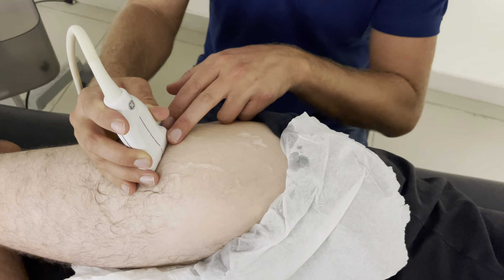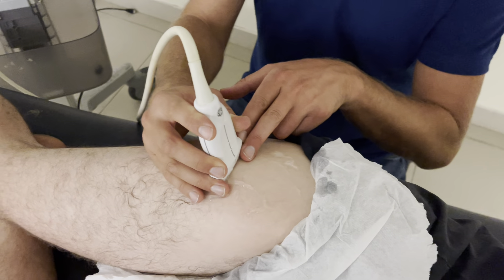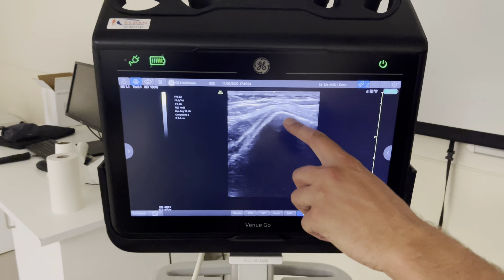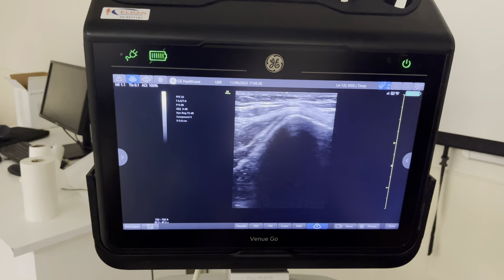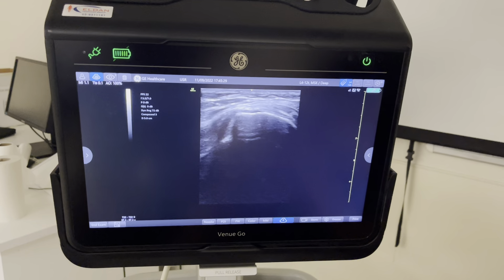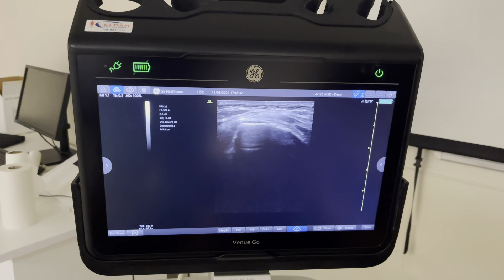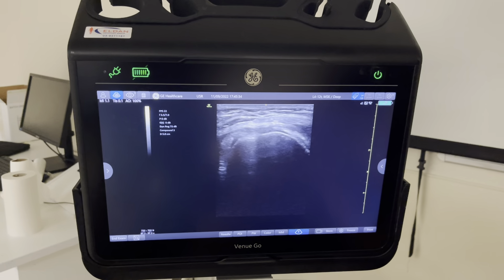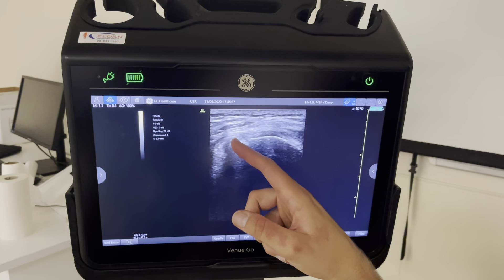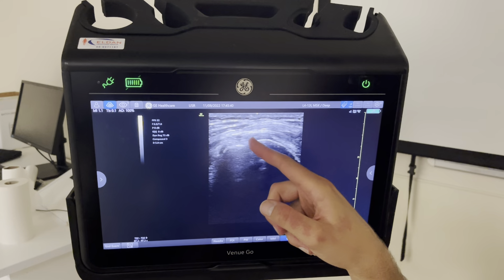We start again at the same point on the femur and go up until we find our important landmark in the middle, which is the bony eminence right there. And then everything lateral to that — going more lateral and a little bit more cranial — we see a tendon coming in between. So all this is the tendon, as you can see.